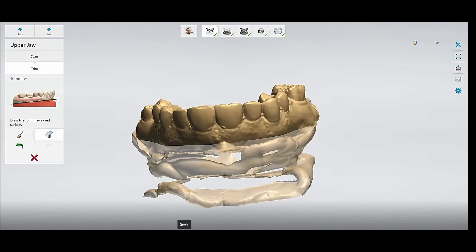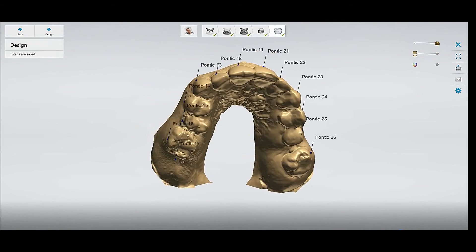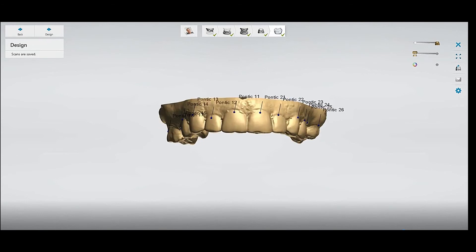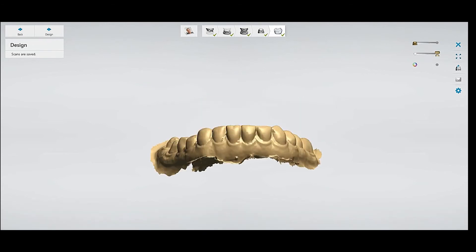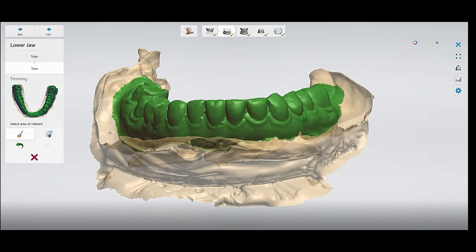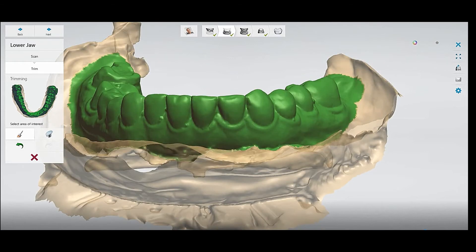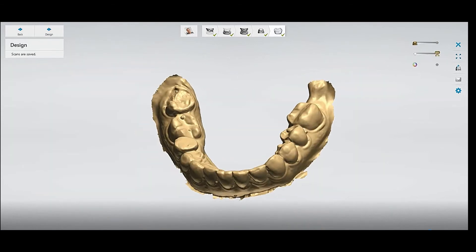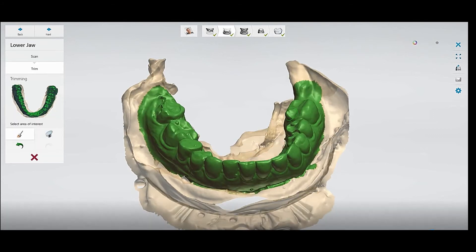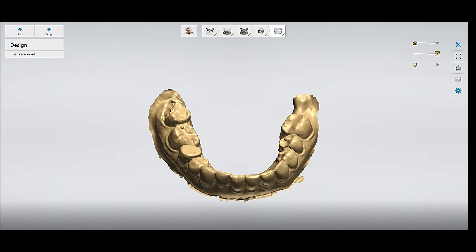Now you can see after the cutting what it looks like — also the lower scan. You can check if you have missed something. So, these are the two ways you can trim a scan with the desktop scanner.